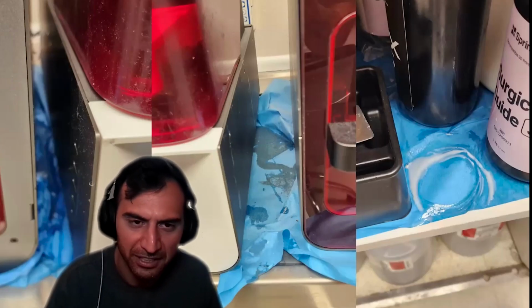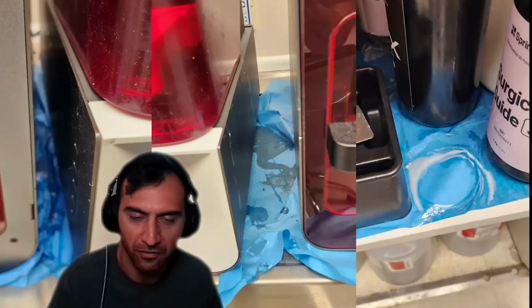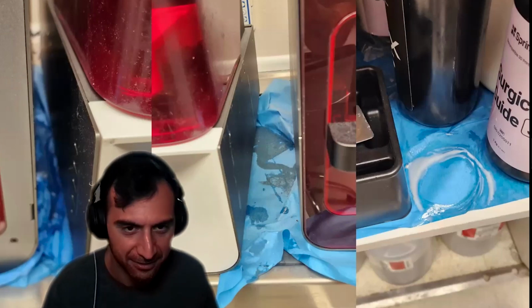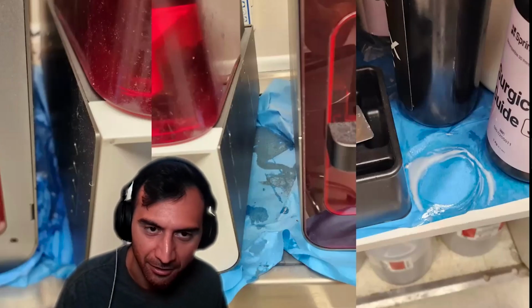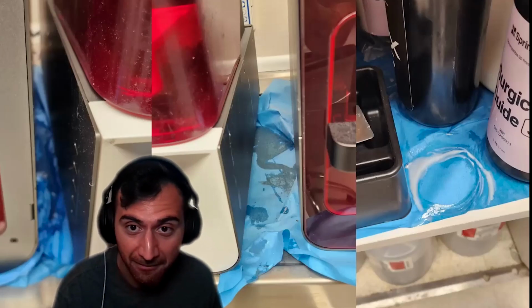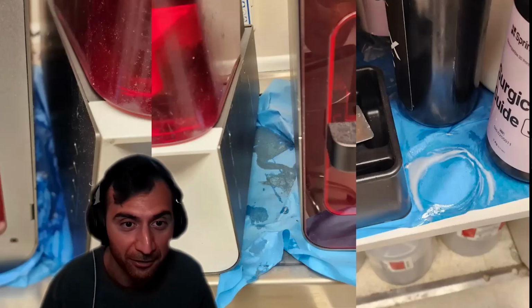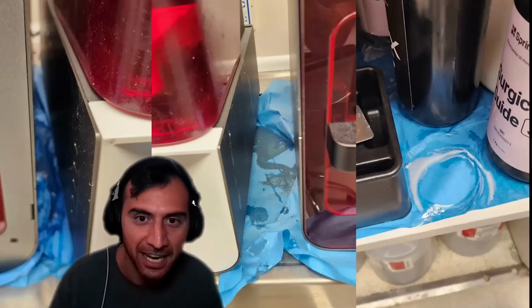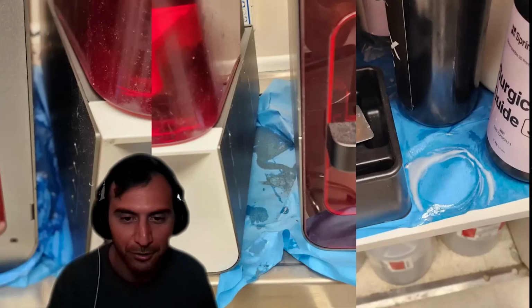It's like, you ever mess with a jar of honey, or you don't even have to touch a jar of honey. You open up the cabinet that has the jar of honey and you look at it, then you close the door, and then somehow, in some magical way, there's honey on your fingertips. I don't know how it happens. I feel like David Blaine is sitting there just rubbing it on your fingertips when you're not looking, but it happens. And the same thing happens with this resin. So get ready for a little bit of mess. But it's as simple as putting paper around.